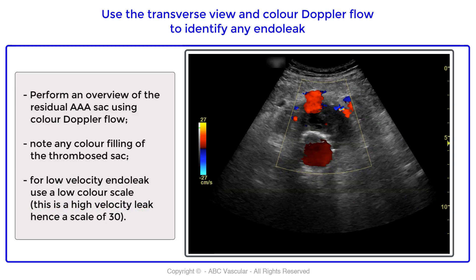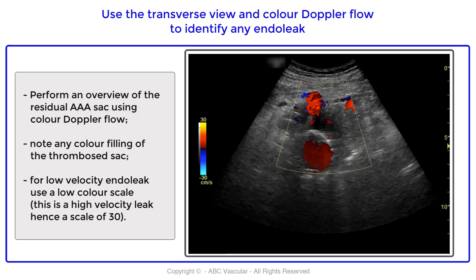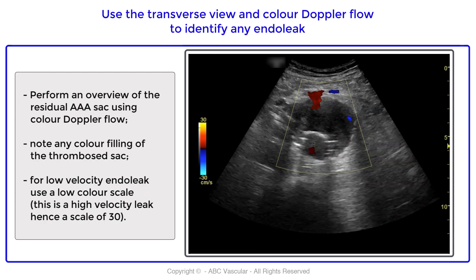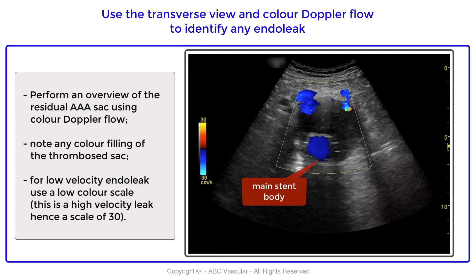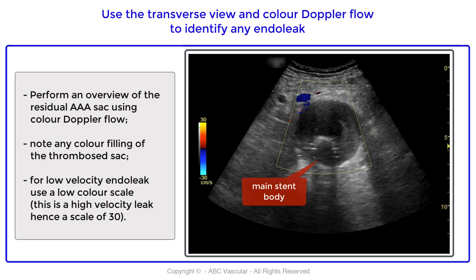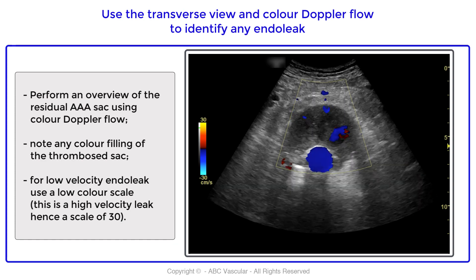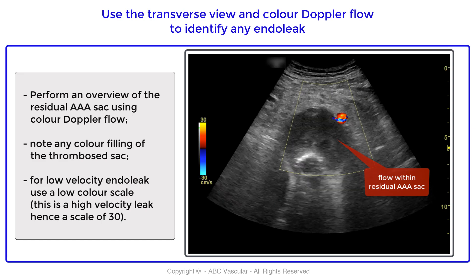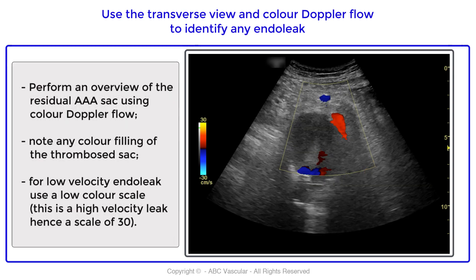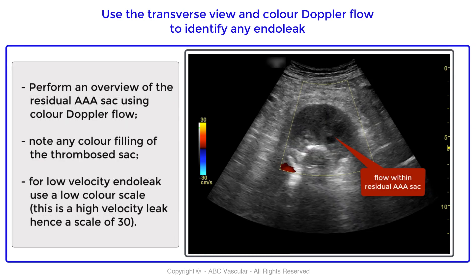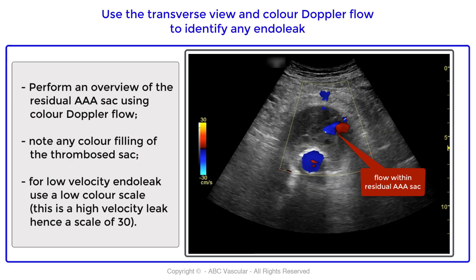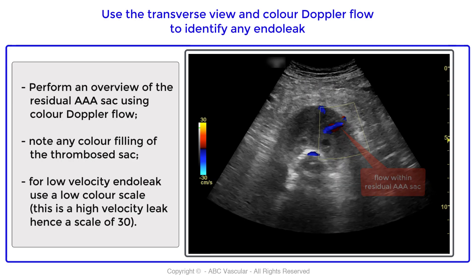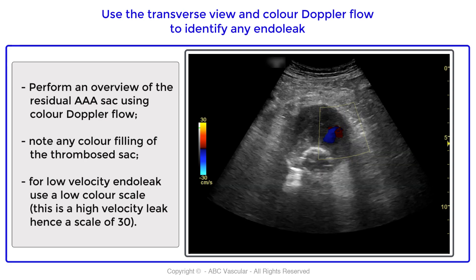We then apply color Doppler flow and perform an overview of the endovascular repair to identify any flow filling within the thrombosed residual AAA sac. We can spot evidence of color flow entering from a blood vessel which is outside of the residual thrombosed abdominal aortic aneurysm.